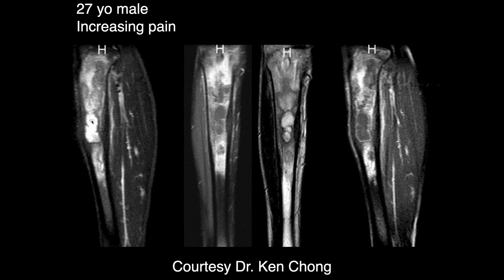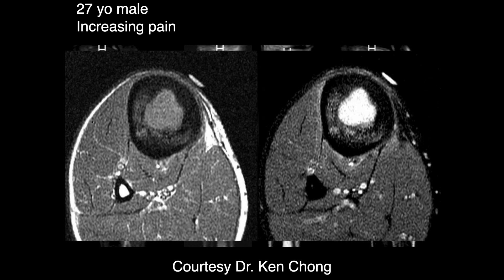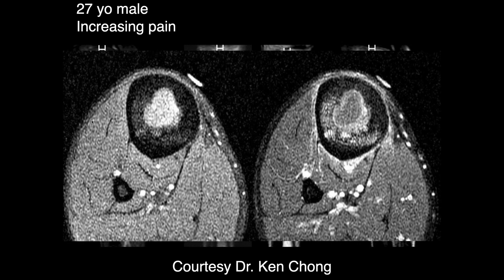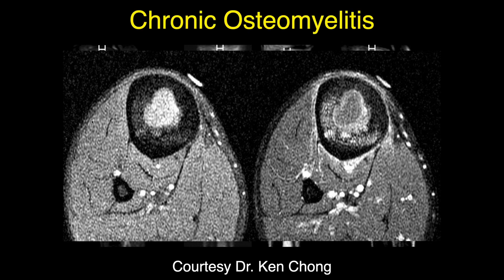In fibrous dysplasia, wouldn't the cortex be thinned rather than thickened? It can be either thickened or thinned — often you'll get both. But here we see nothing but thickening. We can see that there's a lot of signal within the cortex, and this was chronic osteomyelitis. But in situations like this, you'd always have to think about the possibility of adamantinoma.